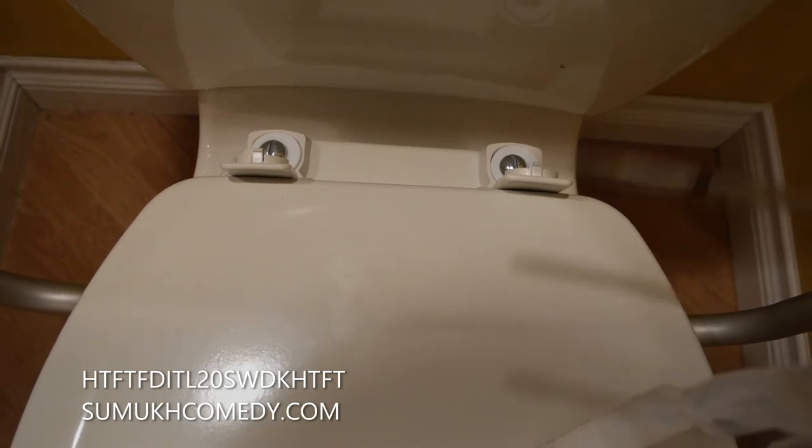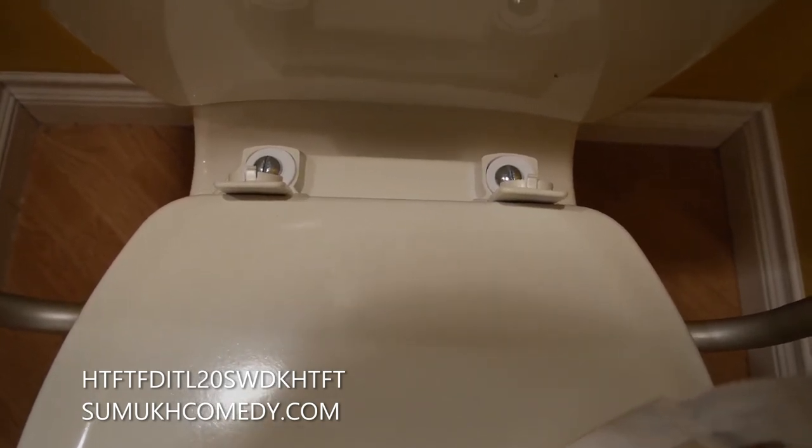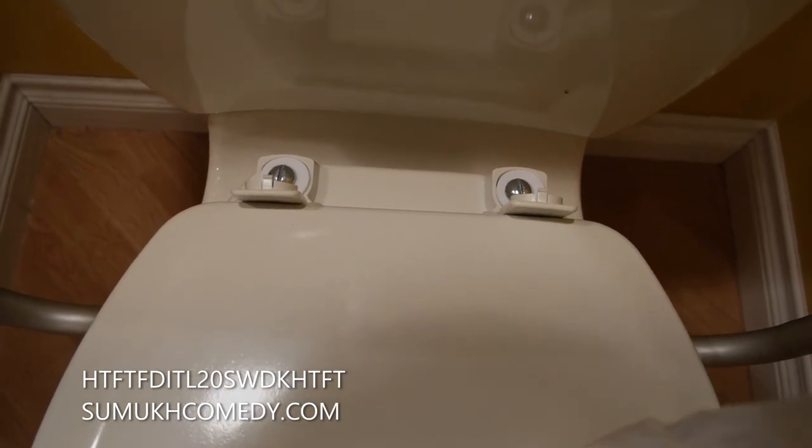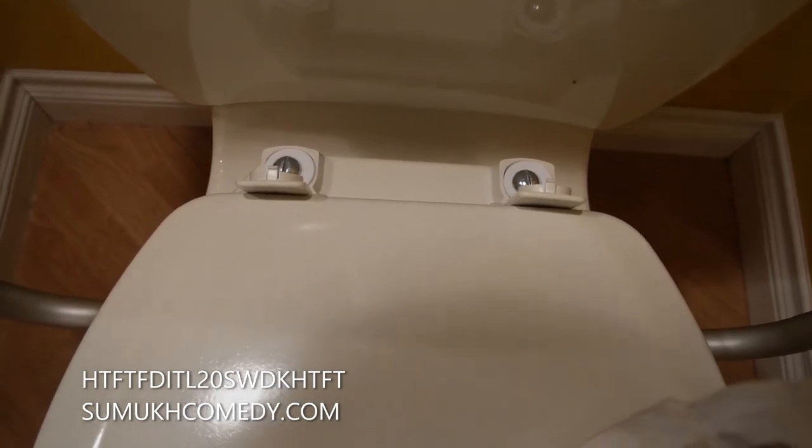Tightening it helps make it very strong, and now able for a butt up to 300 pounds to be able to sit on and enjoy. I've never actually sat on a toilet where my feet don't have to touch the floor.